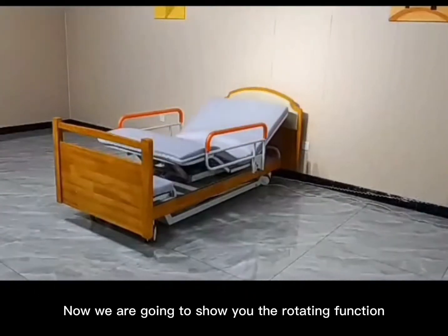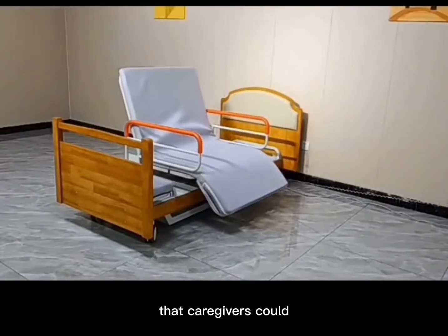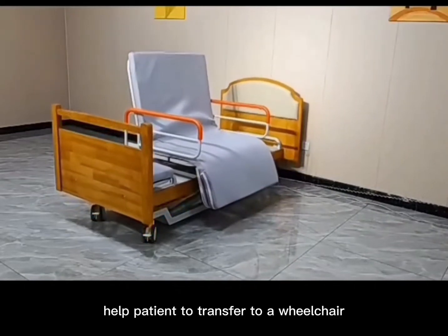And now we're going to show you the rotating function. At this position, the caregivers could help patients to transfer to a wheelchair.